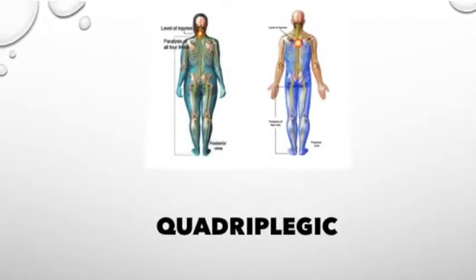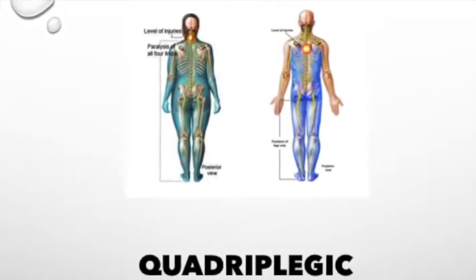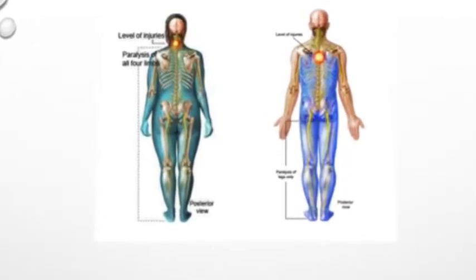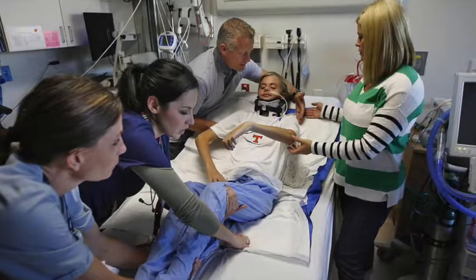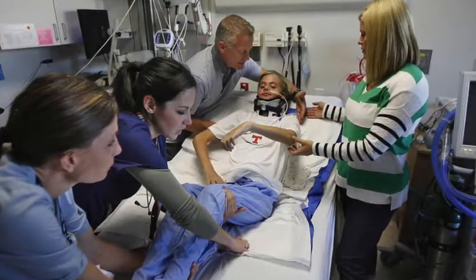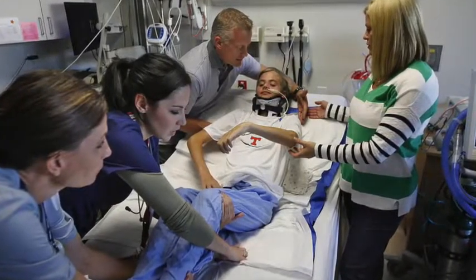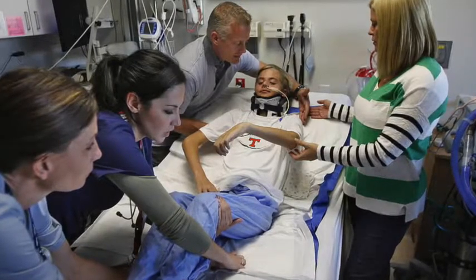A quadriplegic person is one affected with partial or complete paralysis of both the arms and legs, especially as a result of spinal cord injury or disease in a region of the neck. Due to the lack of fully functioning limbs, quadriplegic patients often need assistance to control even basic conditions of their rooms. The BCI we designed can help quadriplegic patients control different aspects of their room's environment, allowing a person to regain independence at least in this perspective.